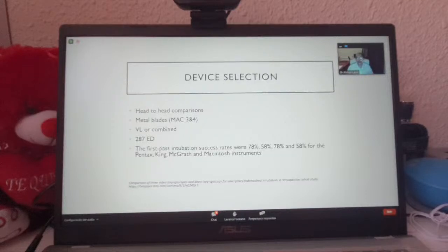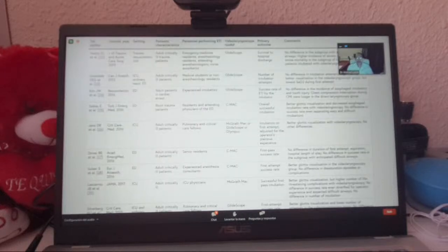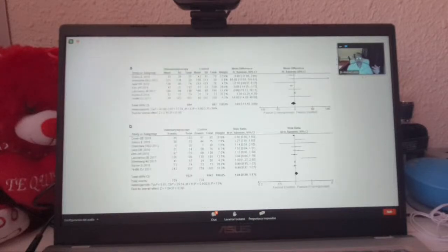Now we're going to do a quick review about device selection. There is a lot of device selection in the market. I'm not going to take too much of your time because I'm aware that we are nearly half an hour into this. Video laryngoscopy in critical care: there have been about 9 studies, 3,000 patients involved. There is a summary of this.